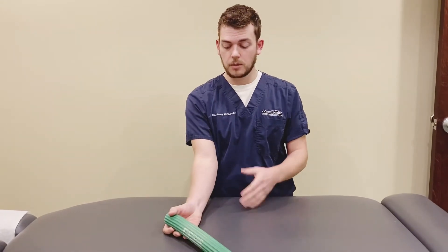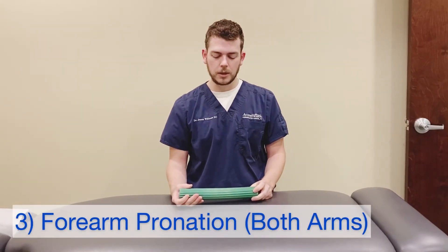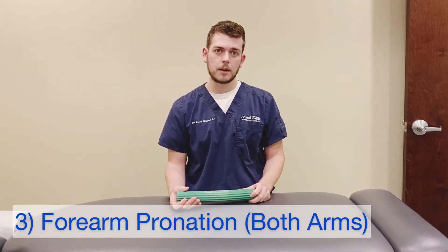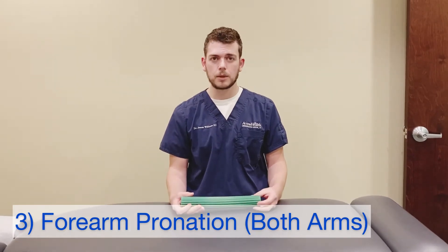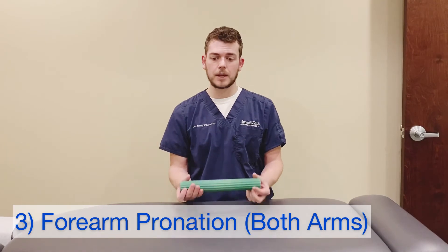It's going to make you sore in this area of your forearm, but it's also going to help create some strength and stability. The other thing that we can do is work both arms at the same time. So if you're having symptoms or weakness in both arms, we can just work both of them simultaneously.